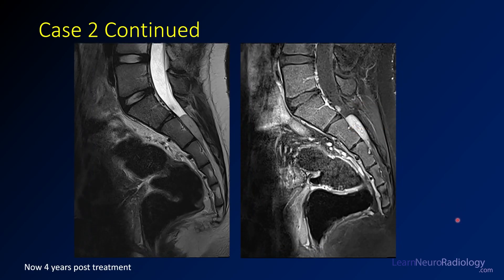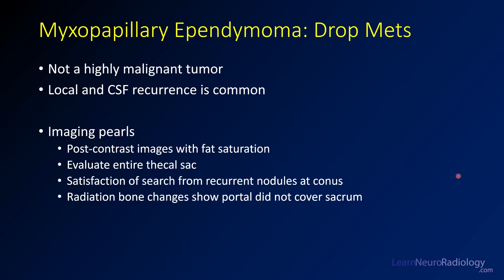On another MRI a year later, a T2 image and post-contrast image show additional nodular areas down along the termination of the thecal sac at S1 and S2 — a nodule there and a nodule filling the thecal sac. These are areas where myxopapillary ependymoma has recurred — drop metastases. Key imaging tips: do post-contrast images with fat saturation to see those nodules, look at the entirety of the thecal sac, and look at areas outside the radiation changes, as those are more prone to drop metastases.